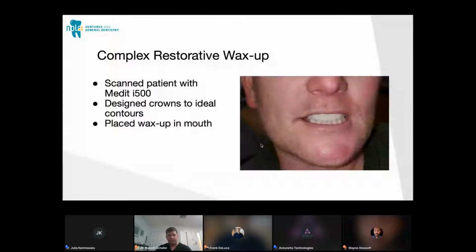So he tried it out, and he and his wife said yes to treatment. Now, I did not let him take this home because he would never come back to my office. He would just use this as a snap-on smile. So he got to put it in his mouth for a few minutes, however long he needed. And they said yes to treatment. Next one.